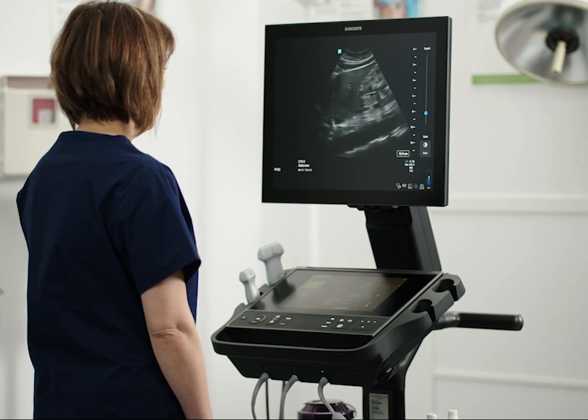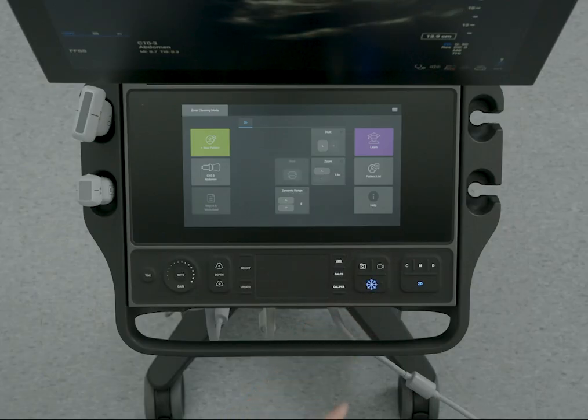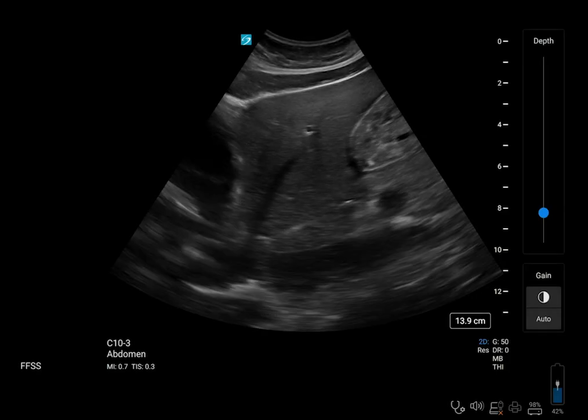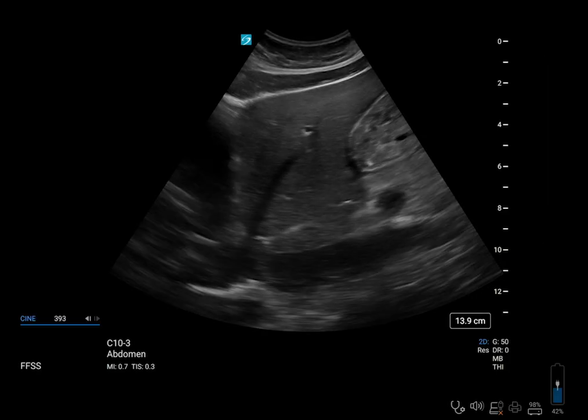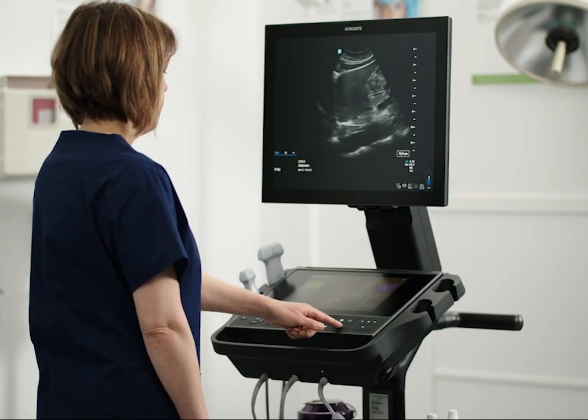Now that we've optimized the image, let's freeze it by pressing the Freeze button. When the image is frozen, you can take a measurement. Watch the help video, Taking Measurements.